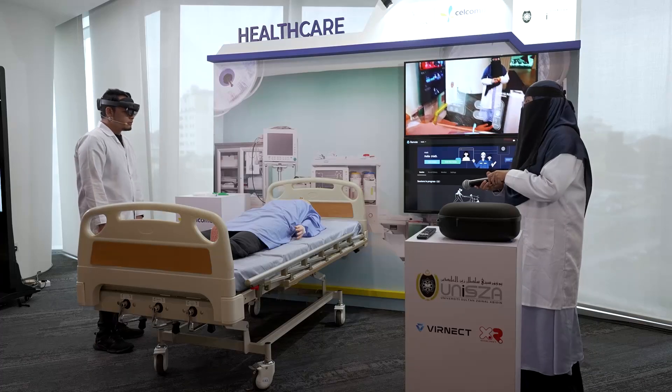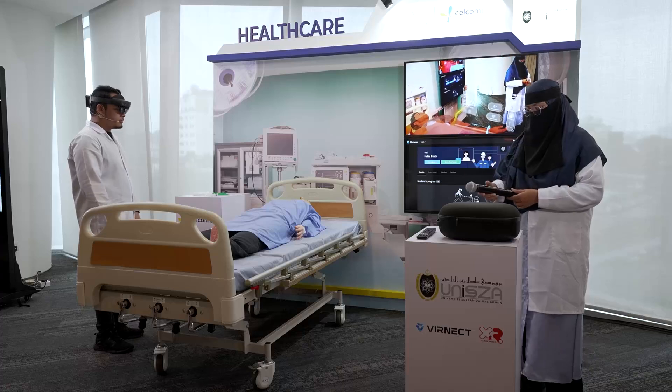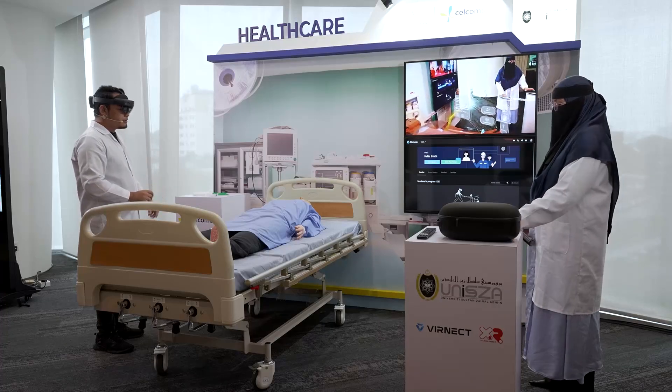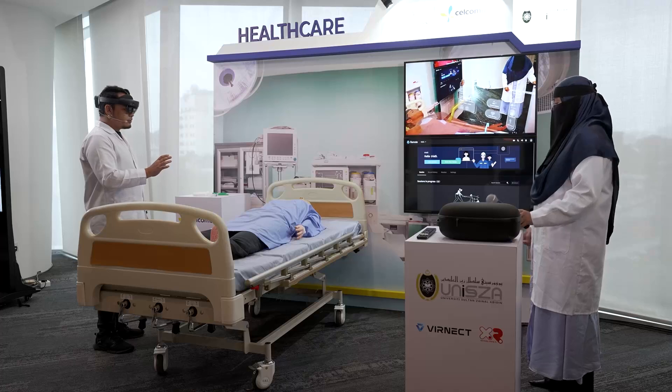Hi, I'm Amai. I'm wearing the HoloLens device, and this device can detect my hand gestures as you can see here. I will show you the medical holography experience. In front of me is the patient interface.